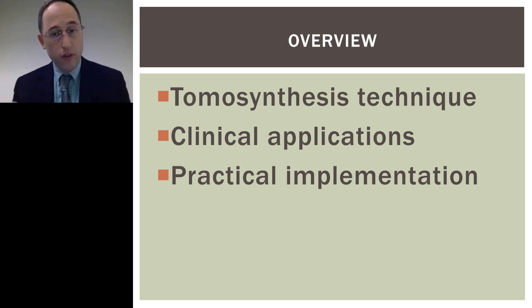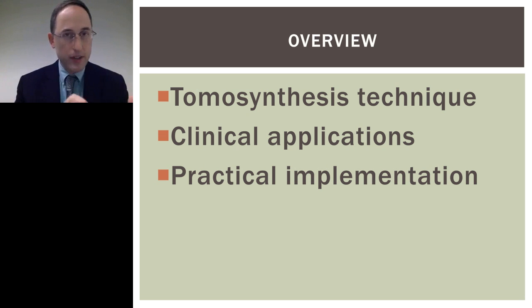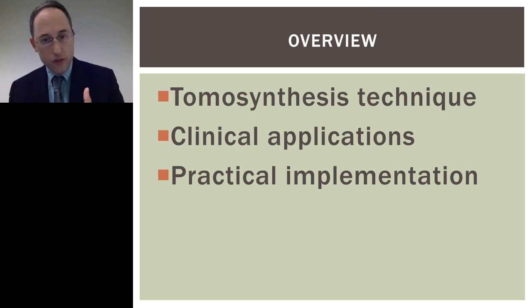So as a quick overview, I'm going to first discuss tomosynthesis as a technique, and that is going to be things like, how is the equipment used, how does it make the images, and how does it technically compare to CT and radiography in terms of how it generates the pixels that we see on the screen.